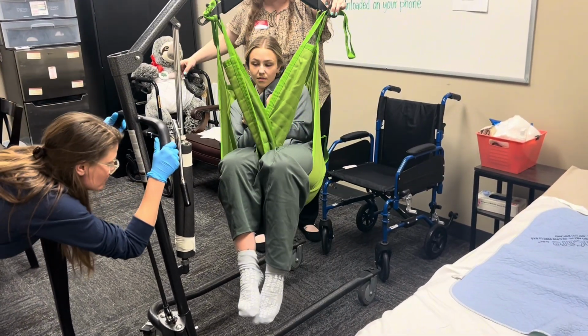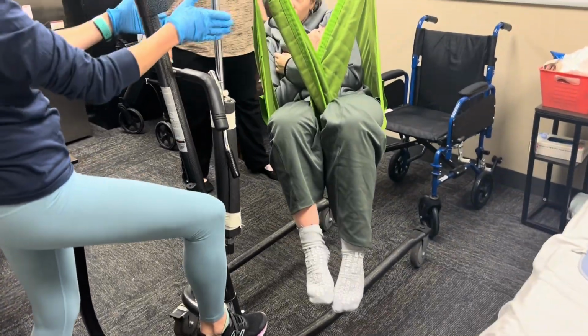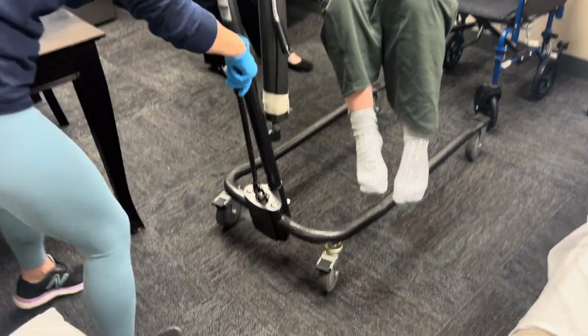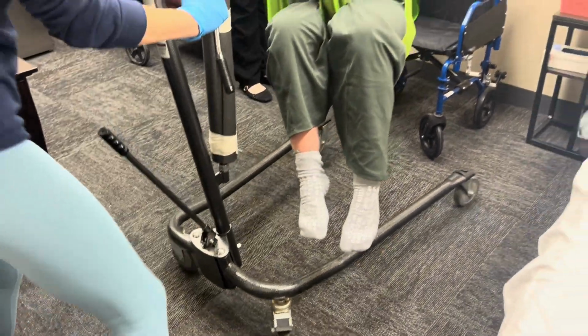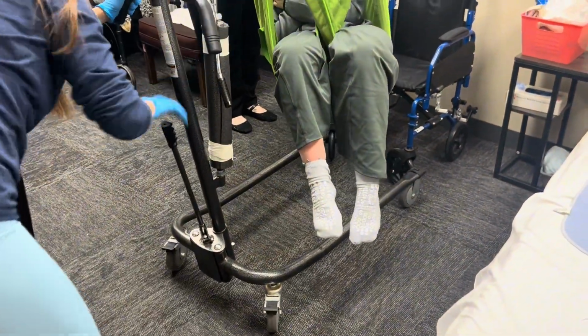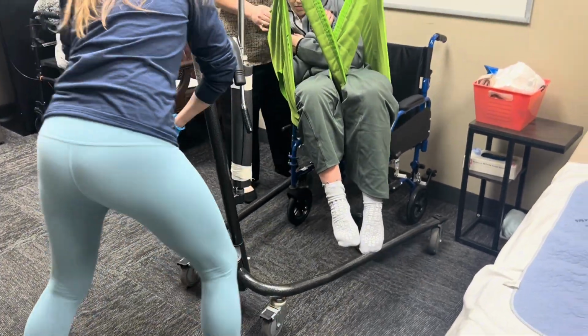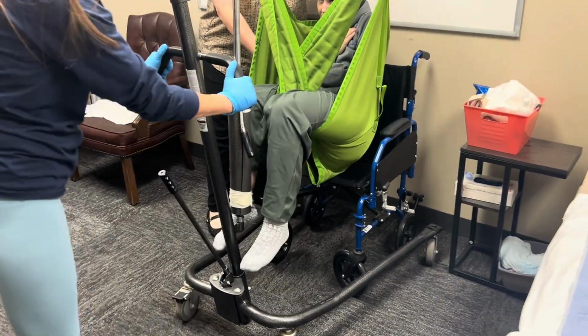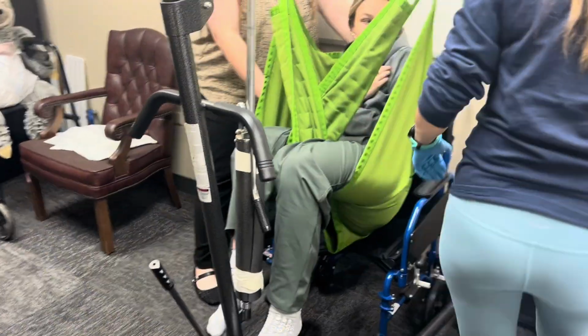Because the legs of the wheelchair are too skinny and I can't get these legs underneath, I'm going to widen the legs of the Hoyer lift so that I can get them around. Thank you for helping me guide. So when I'm here, as a family member, you're kind of just guiding. I'm going to lock it. And since I'm the caregiver, I will be doing a little bit more of the work.